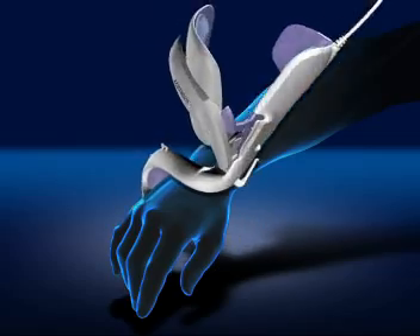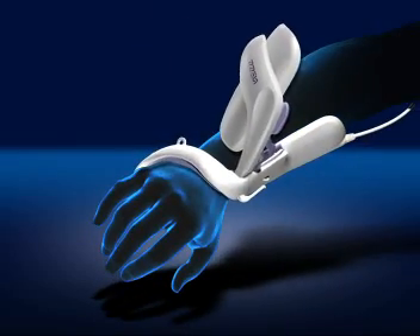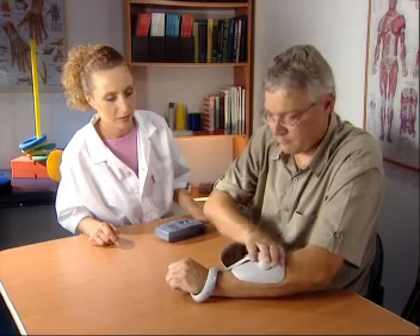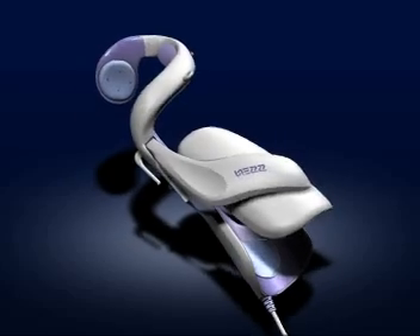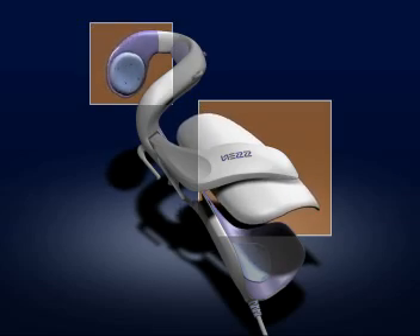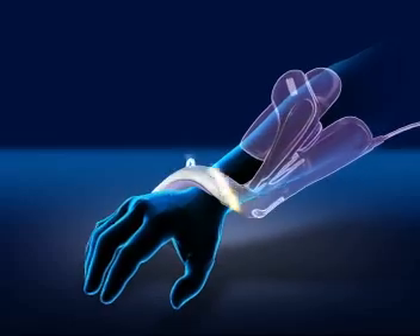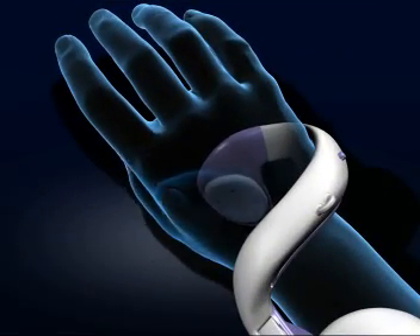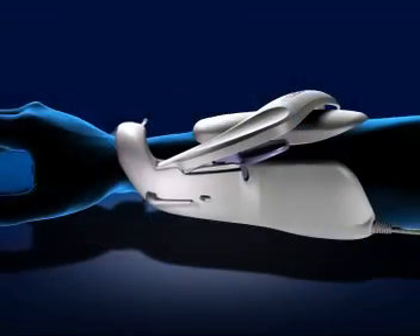The Ness H200 Orthosis comfortably embraces the arm, and it is easy to put on, remove, and position accurately. The unique integration of flexible components and exoskeleton rigidity provides stability and durability, facilitates movement, and maintains optimal electrode contact.